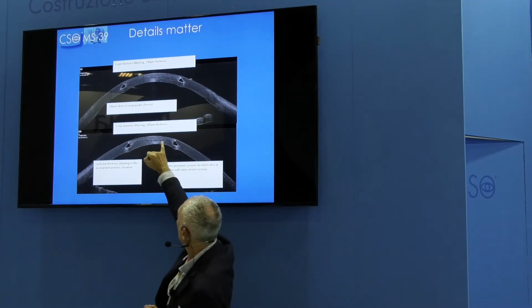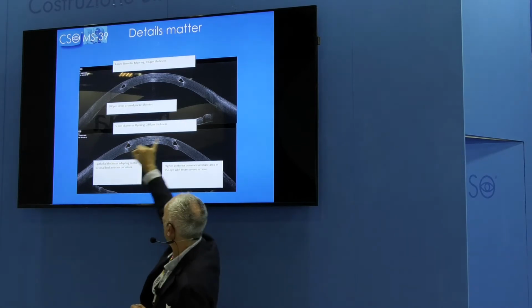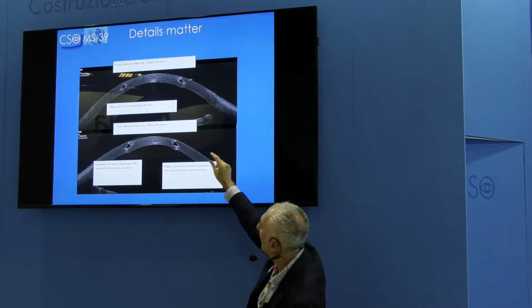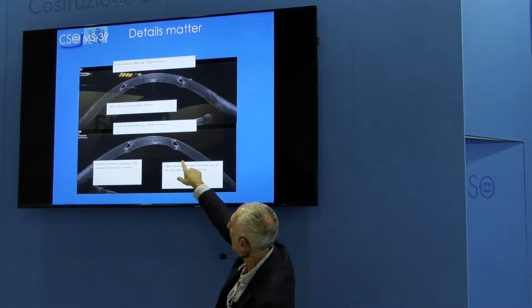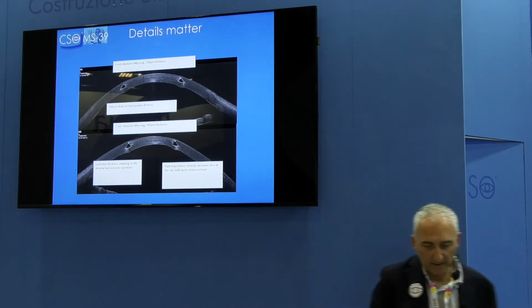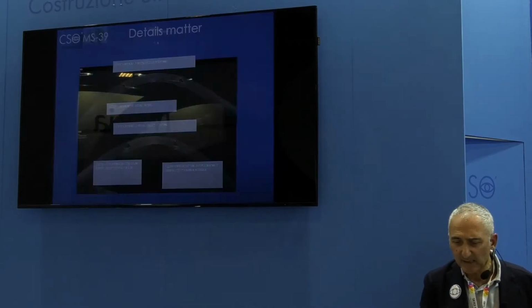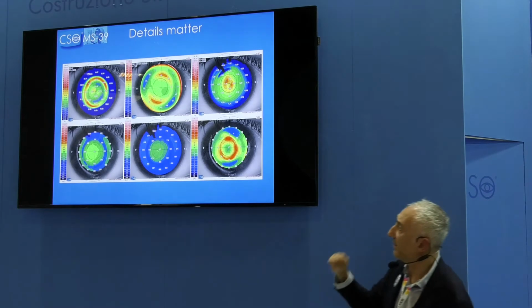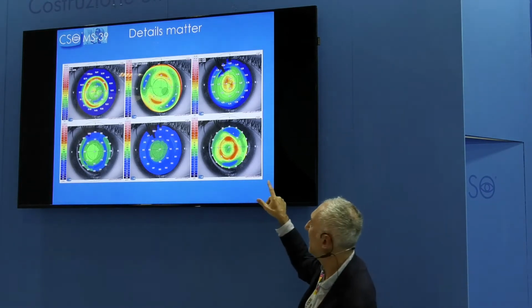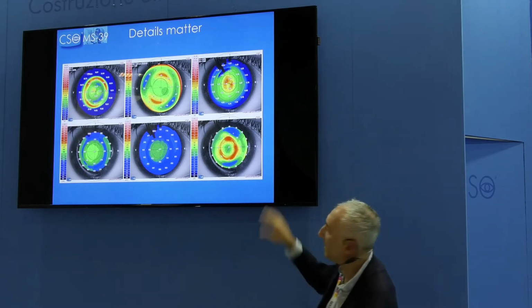Here you see all the modifications of the thickness of the epithelium and the distance of the ring, all the details are there. We can also look at those details as a map, so all the points can be measured.